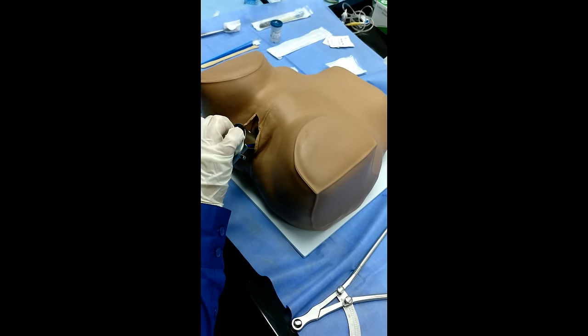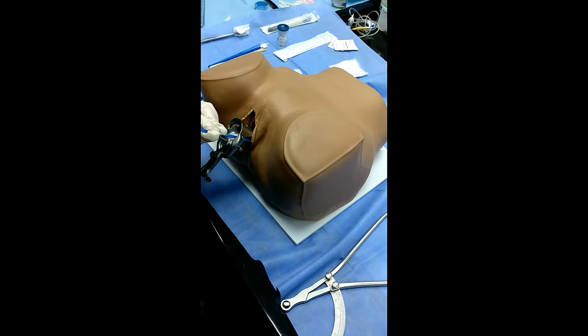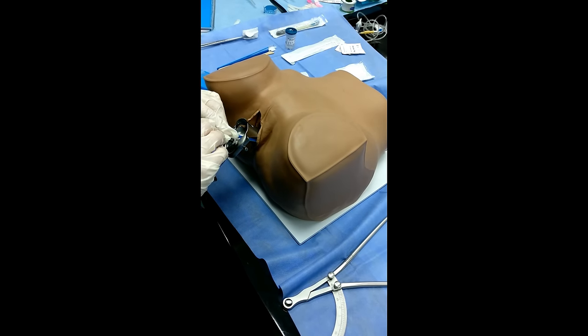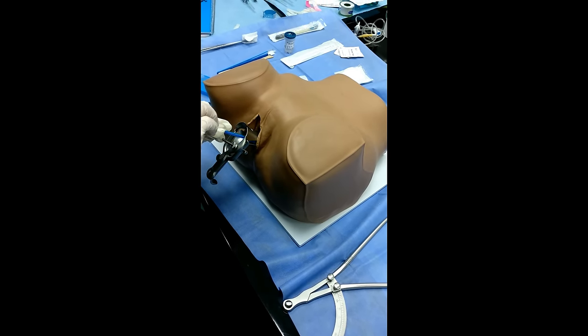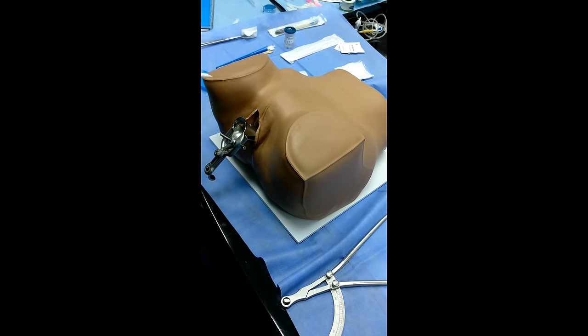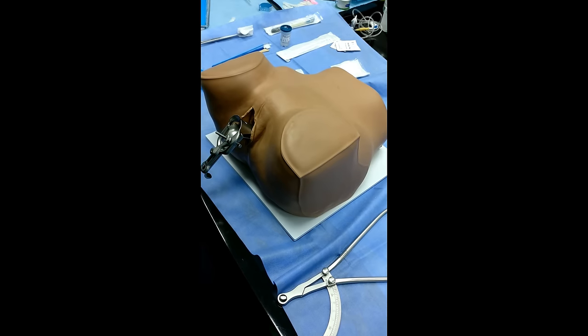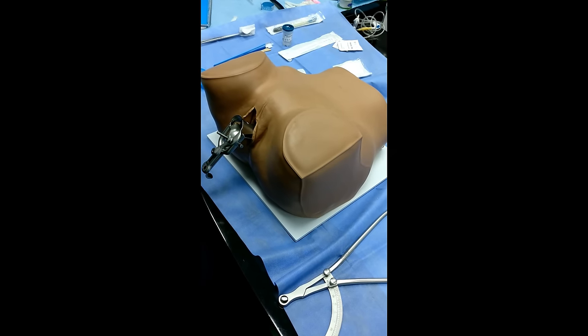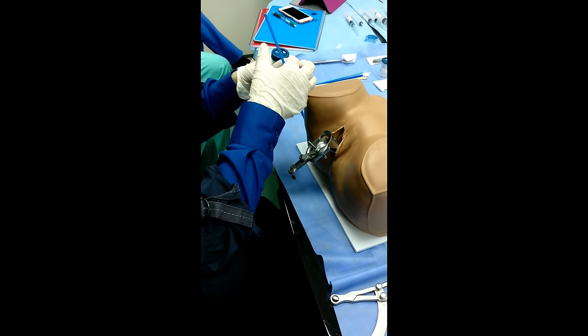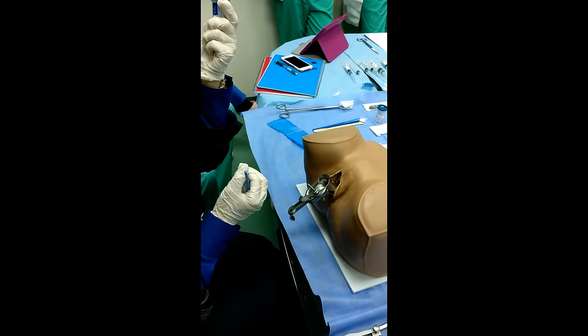we perform 5 rotations in a clockwise direction. After that, we introduce the brush into the container, we agitate about 10 times, we remove the brush, and we label the container with the data of the patient.